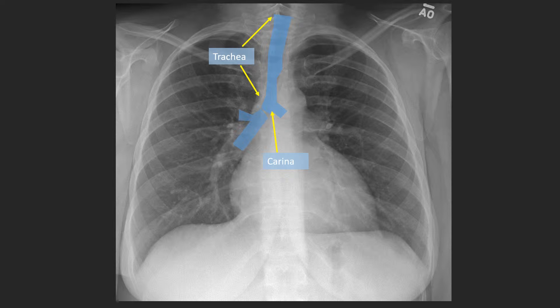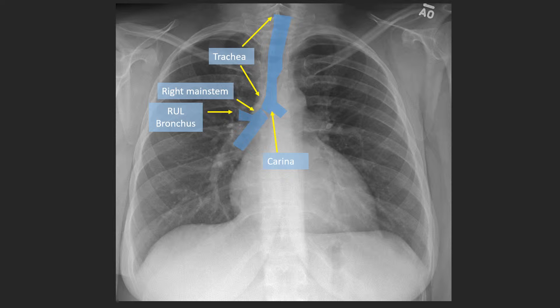The very short and vertically oriented airway here is known as the right main stem bronchus. This is frequently why endotracheal tubes, when placed too low, end up on the right side, or when you aspirate something, it goes into the right lung — it's the orientation of the right main stem airway. The right upper lobe bronchus comes off almost immediately from the right main stem airway and appears very horizontal. Just after the right upper lobe bronchus, we see the bronchus intermedius, which is very vertically oriented.